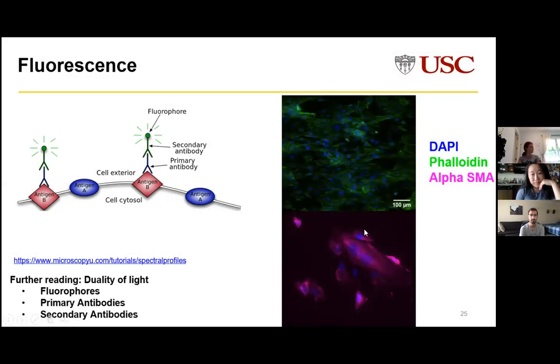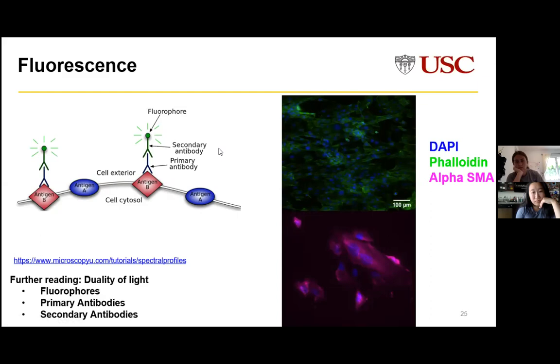If you look at the image in the bottom right hand corner, the pink stains are pretty fuzzy, and what I wanted to be able to see was more fiber. So I know that the stain isn't working particularly well, or that my cells aren't working. Right now I'm assuming that my primary antibody isn't working quite well, so I'm shopping around for different antibodies. That's just an example of a project or a troubleshooting technique that you might run into as a PhD student.